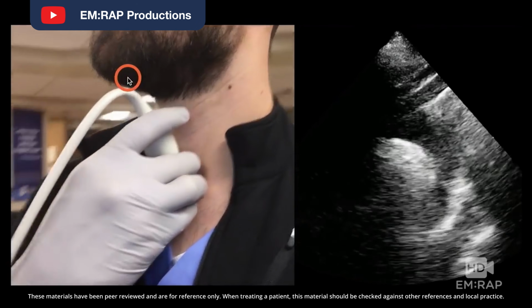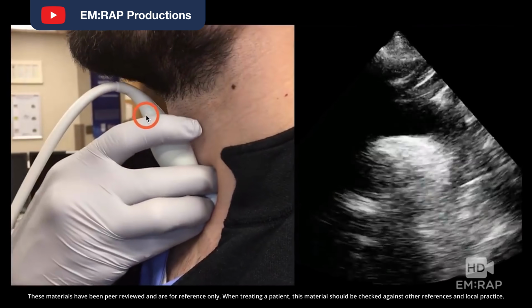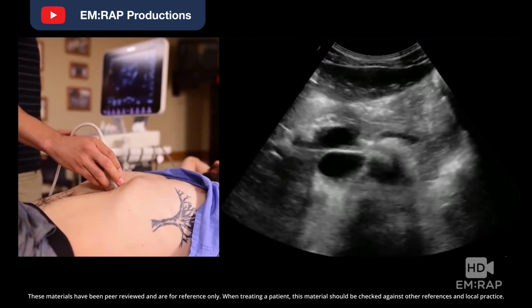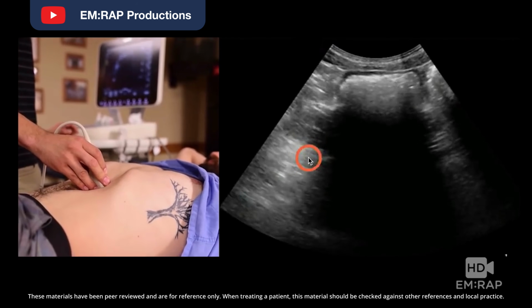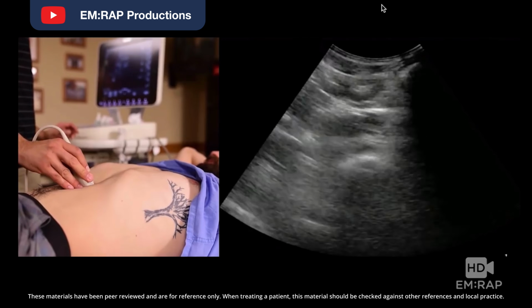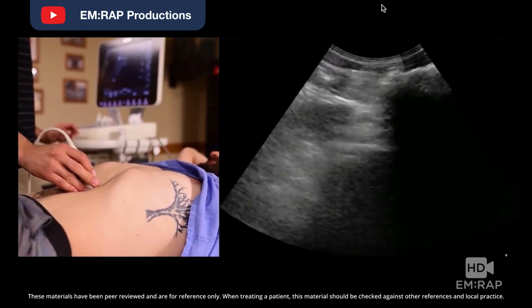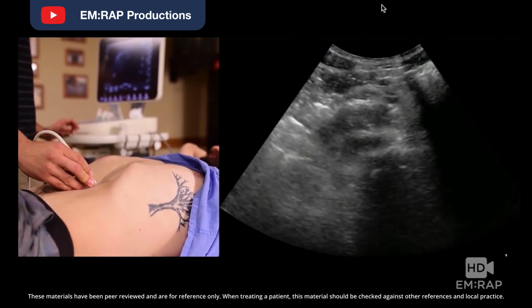The best location to see the aortic arch with a point-of-care ultrasound is the sternal notch, and the best location to see the descending aorta is along its length to the left of the midline. The talented team at EMWrap put together a great video on aortic dissection ultrasound that looks at this in detail. We've left a link to them in the video description.